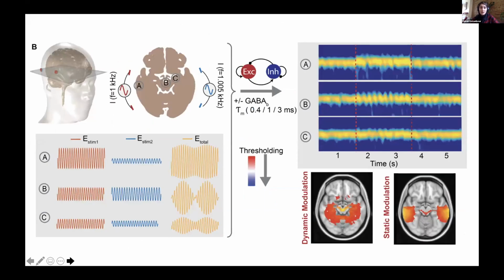In order to see spatially, if we have the interferential stimulation in the brain, how would all this modulation spatially distribute over the head? We technically use each voxel in the brain, and we assume all of these voxels have the same sensitivity as our network, which we know is an assumption that is not true, and then try to spatially see how these modulations would look.